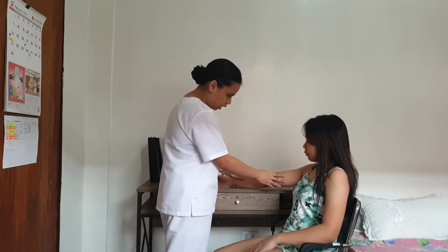Okay. So I will first inspect or palpate which arm I should first use for your initial assessment. Okay? It should be at heart level.